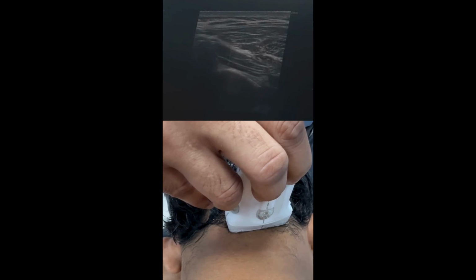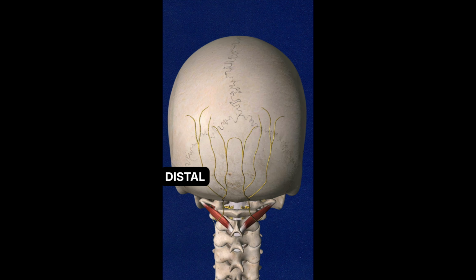The traditional occipital nerve blocks where you just feel for the artery in the posterior scalp and just inject do not work well because the nerve is very distal. That means it has already crossed the fascial planes and come very superficial, whereas the actual problem might lie where it crosses the fascial plane, and that's where it's more liable to undergo entrapment.